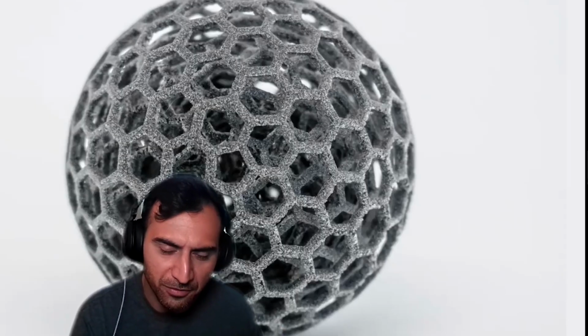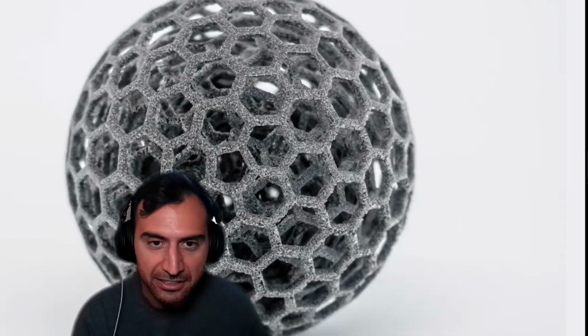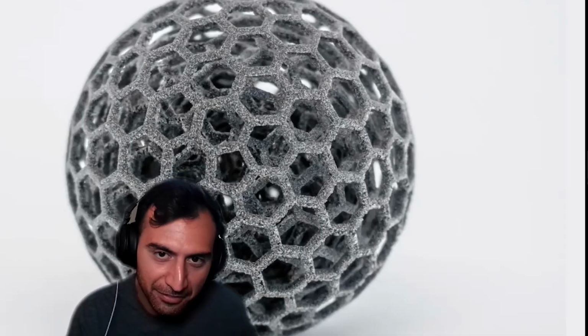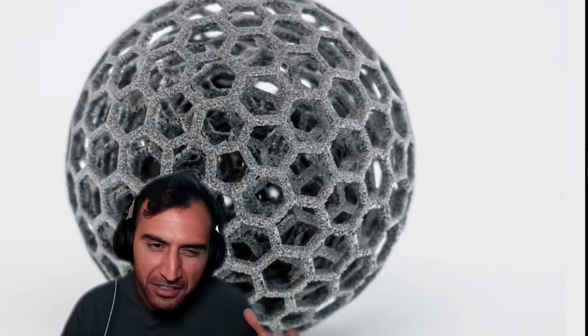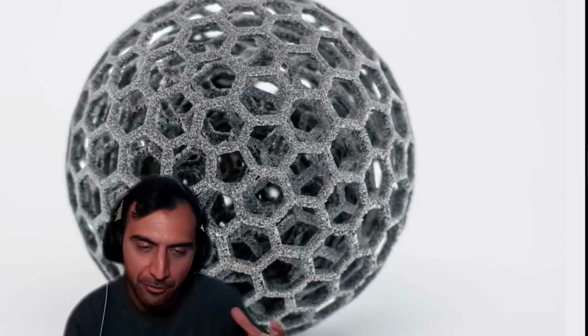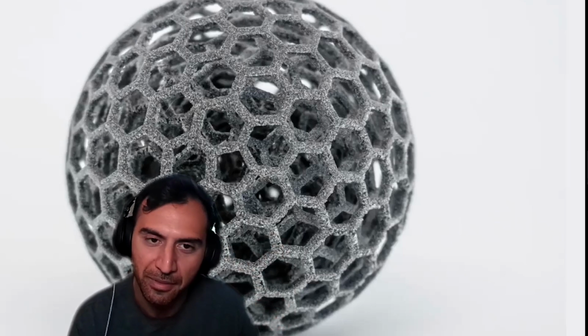But a lot of those forms of 3D printing have limitations in what you're able to create. For example, milling takes a block and you cut back from that block. It's called subtractive 3D printing. You're taking something, subtracting material to create an object. You lose intricacy in your design when you're trying to mill little things inside of a block. You can't get as much complexity of a structure from that.